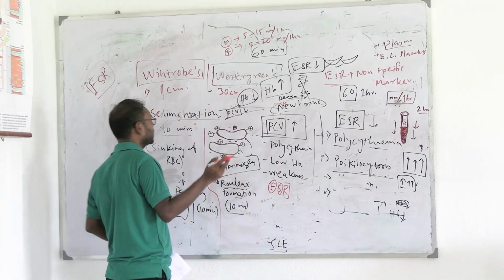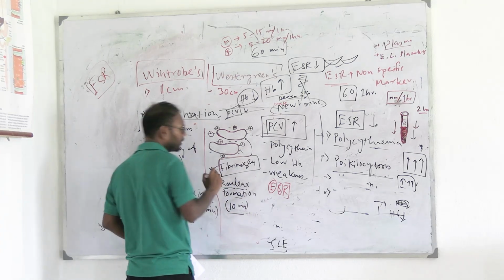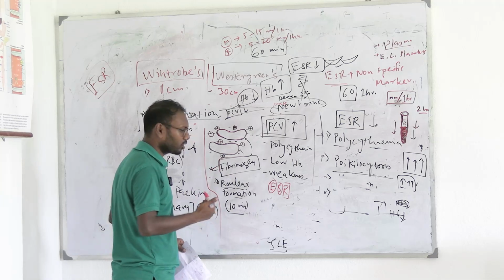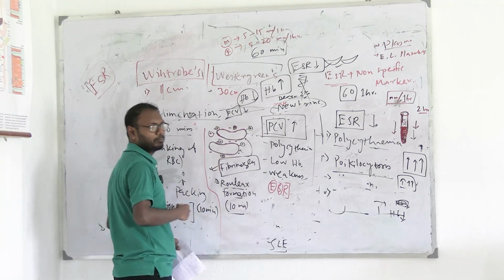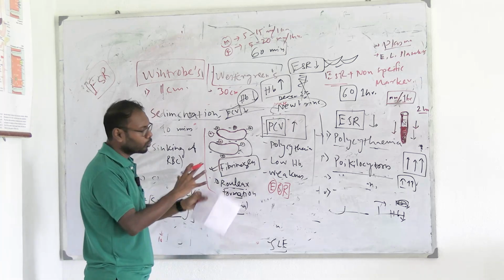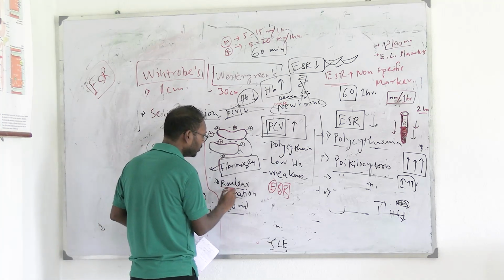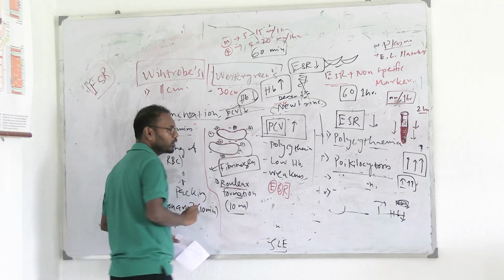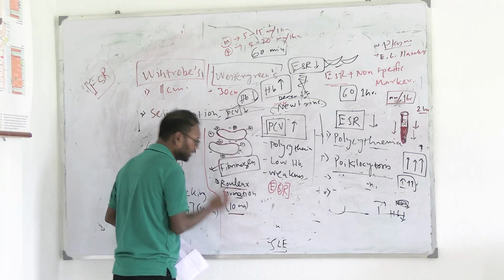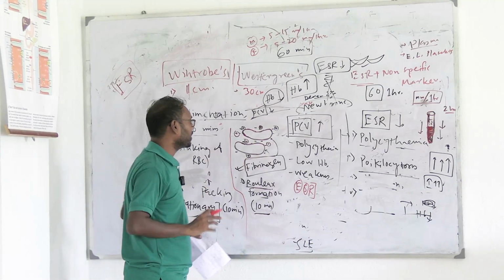So the three procedures are actually, first, coming of fibrinogen into all those layers of your RBCs, to neutralize all the negative parts. So this is so that the RBCs now can come close to each other and get attached to each other. This procedure is called rouleaux formation. It takes about 10 minutes. So all these cells are getting clumped together.